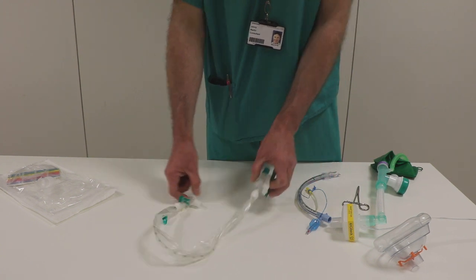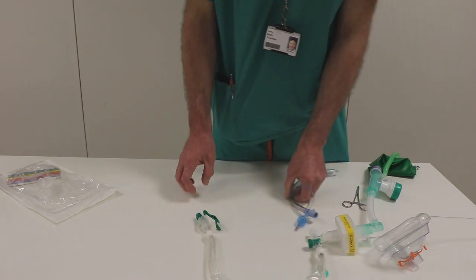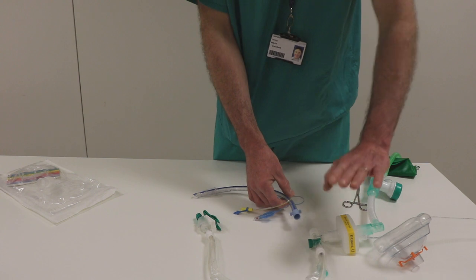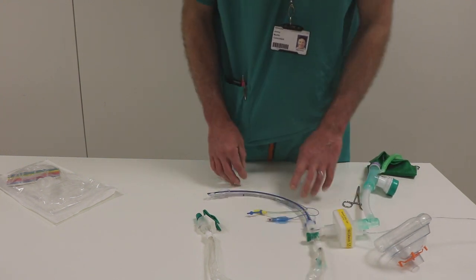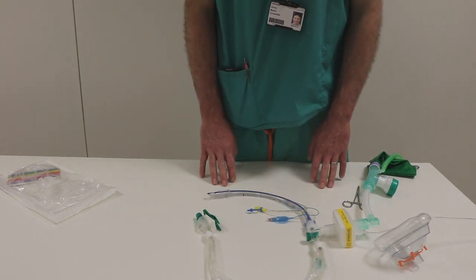Once our patient has been safely intubated, we'll hook this in-line past the filter. Obviously we can't pass the suction catheter through the filter, and then we'll connect our endotracheal tube to that and make it secure.